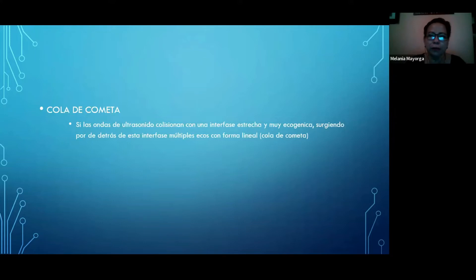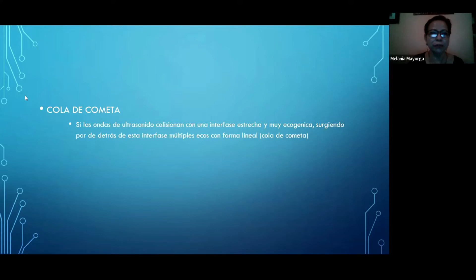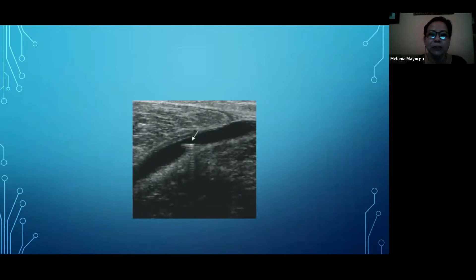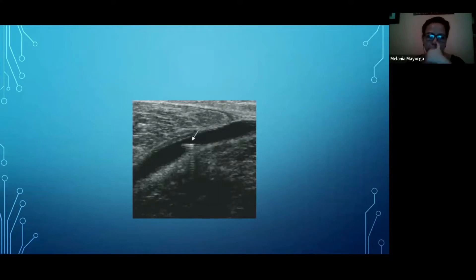La cola de cometa es la más clásica de todas y nos va a servir muchísimo para dar ciertos diagnósticos. Si las ondas del ultrasonido colisionan con una interfase estrecha y muy ecogénica, va a surgir por detrás múltiples ecos en forma lineal, que es lo que llamamos cola de cometa. Lo vamos a ver, por ejemplo, como una imagen dentro de una estructura vascular.